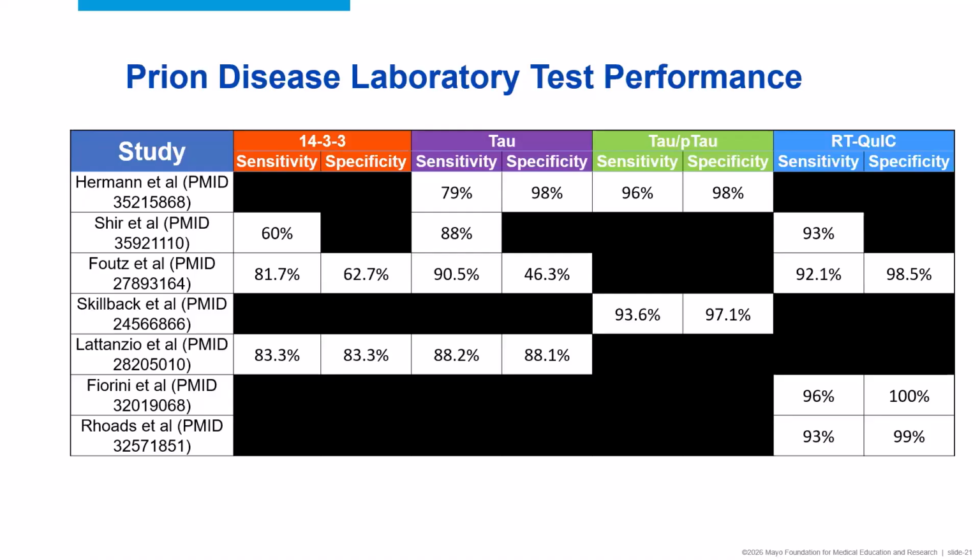Again, these really only emerged clinically in the middle of the 2014, 2015 time period. But these have been demonstrated to have extremely high specificity and very good sensitivity.